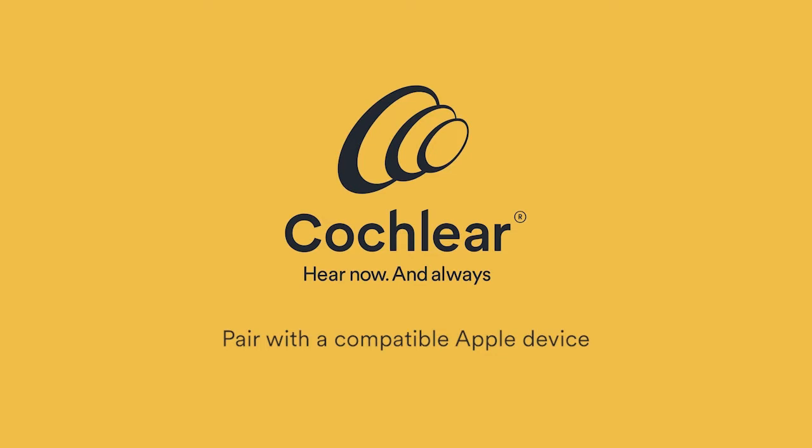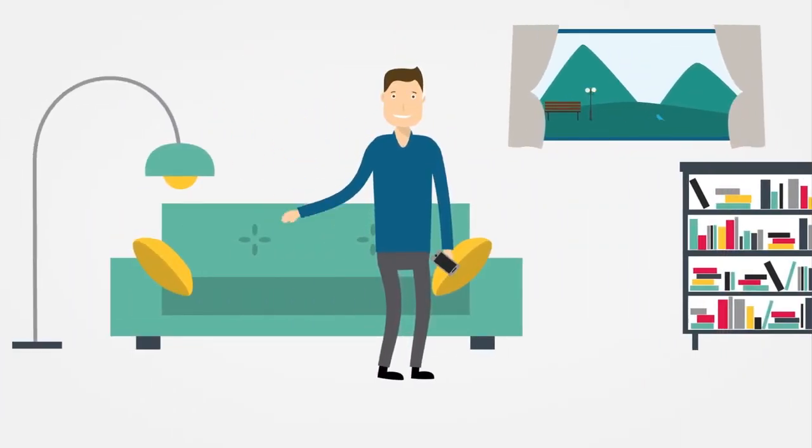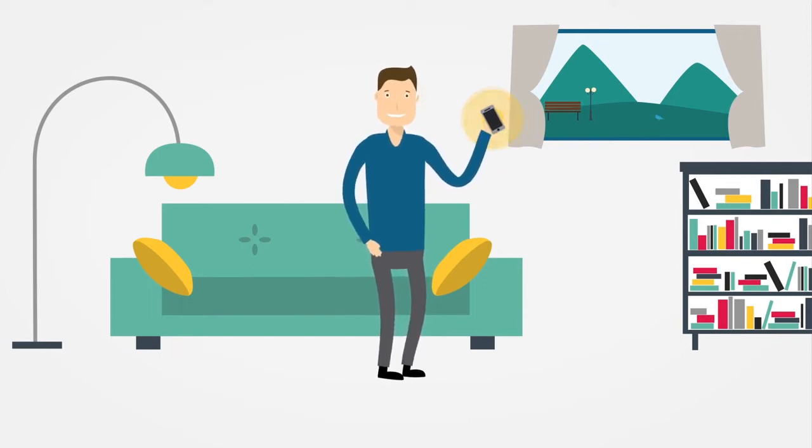To start using the Nucleus SmartApp control and monitoring features, you'll need to pair your sound processor with your compatible Apple device.